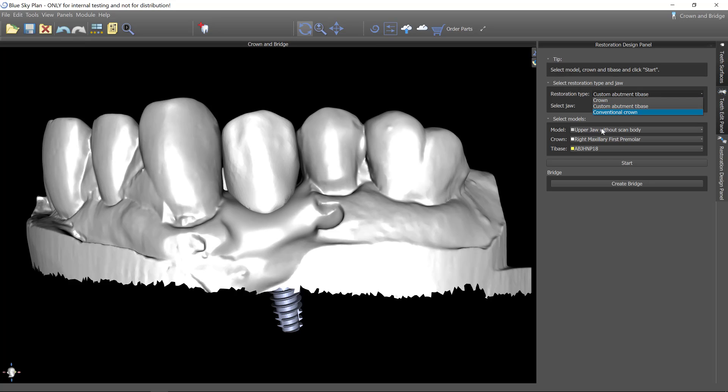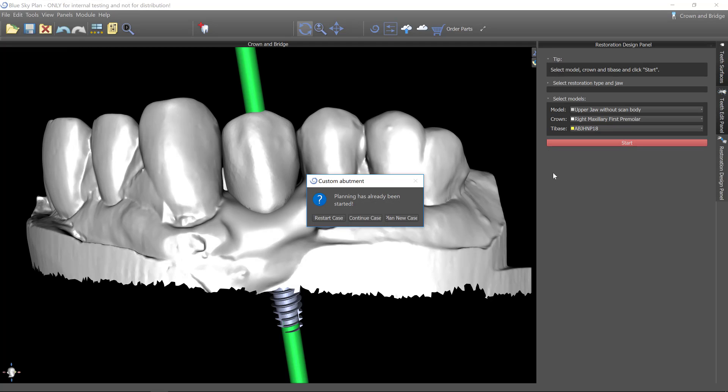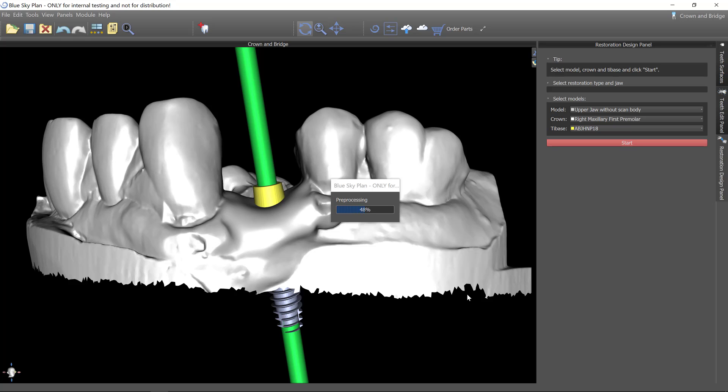We're going to use this as the upper jaw. The crown is the right maxillary first premolar and this is the tie base. So again, all the things that we said earlier when we added the tie base and registered the implant. This is a case I'm redoing for the sake of the video. So I'm going to say restart case.